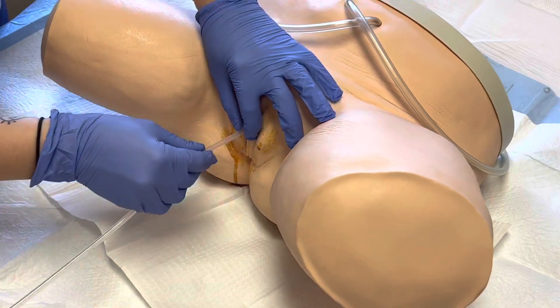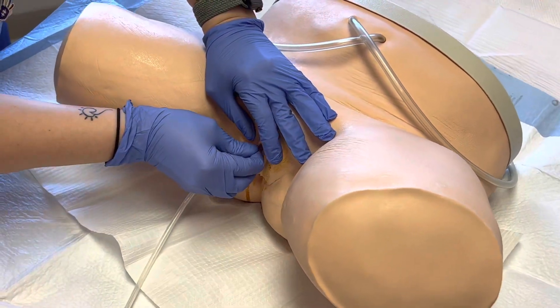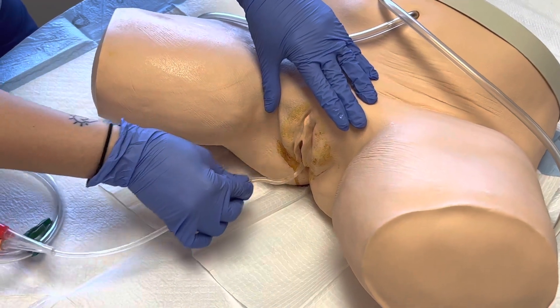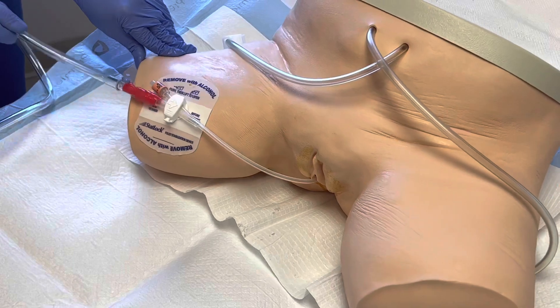Maintain your dedicated clean and dirty hand. The dirty hand should never touch the catheter, and the clean hand should never touch the patient. Secure the catheter with a securement device. This prevents the catheter from sliding in and out of the urethra, which could cause injury and or introduce bacteria.